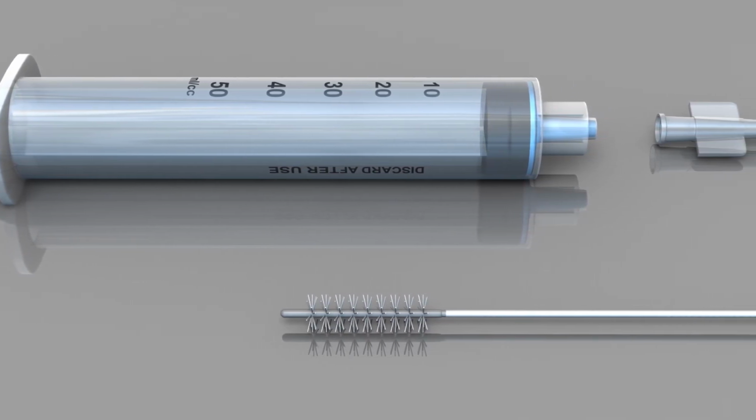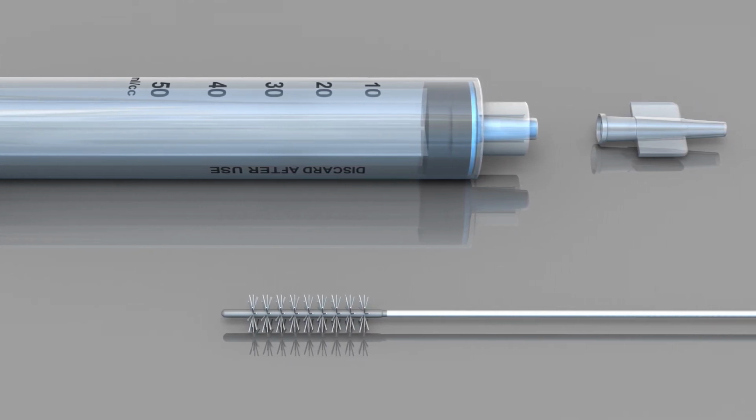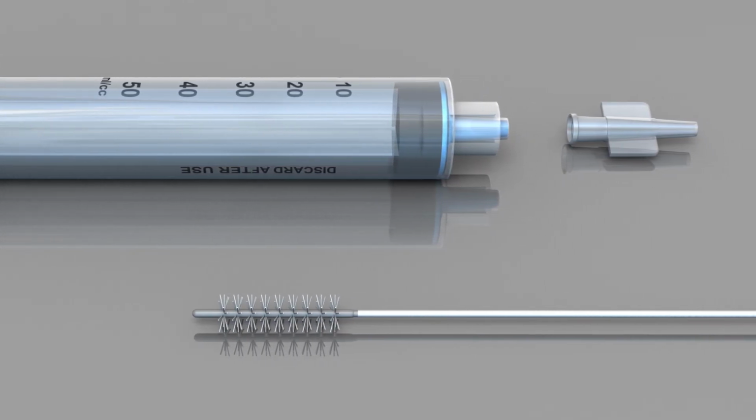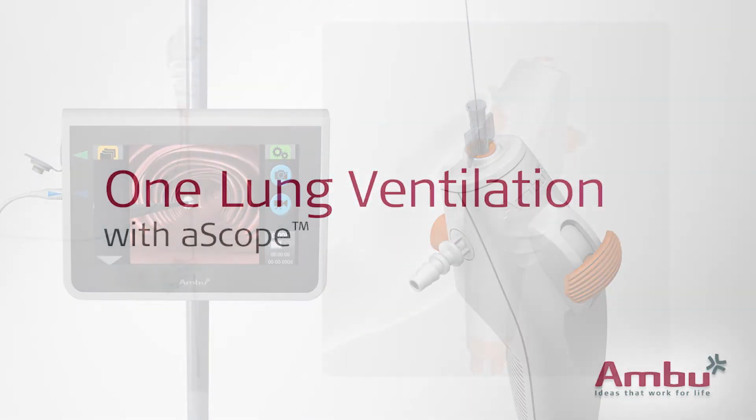Inspect the accessory before using it. If there are any irregularities in operation or appearance, replace it. Insert the accessory into the working channel port and advance it carefully through the working channel until it can be seen on the aView monitor.